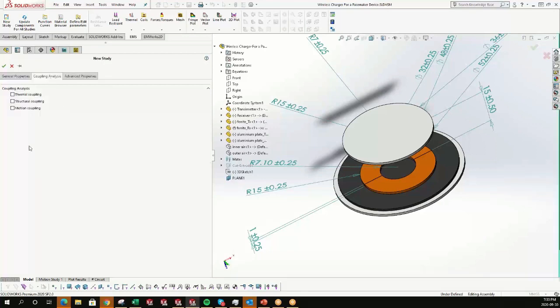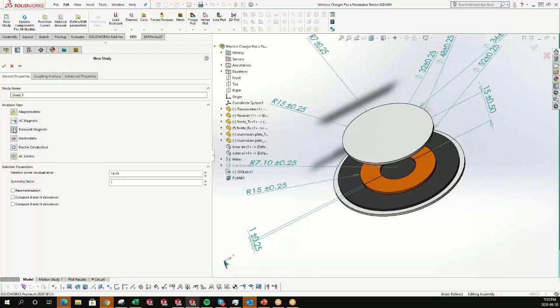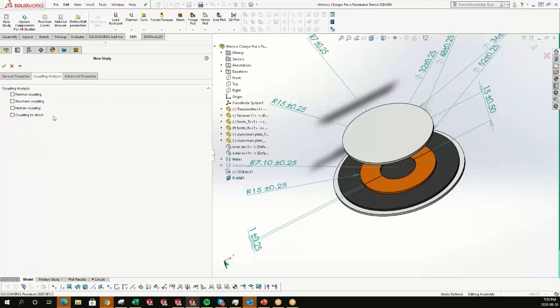Now we can move to the next tab, which contains the coupling options. Just let me switch to this one. So we have thermal coupling. We can couple our magnetic or electric studies to thermal, to structural, or to both of them. Then we can couple our electromagnetic or magnetic simulation to motion, to SOLIDWORKS Motion. And we use the coupling to circuit in our simulation to simulate a resonant circuit, for example.